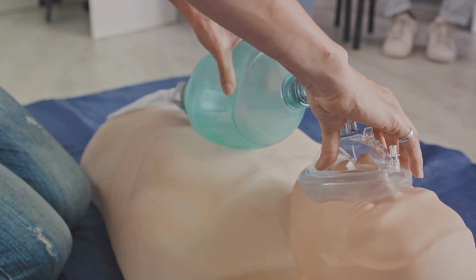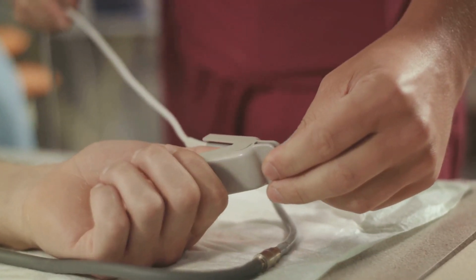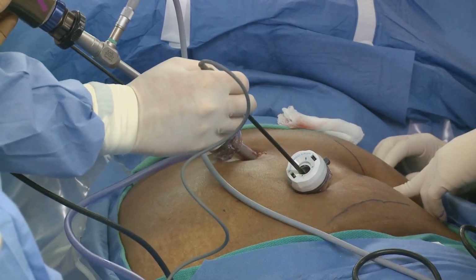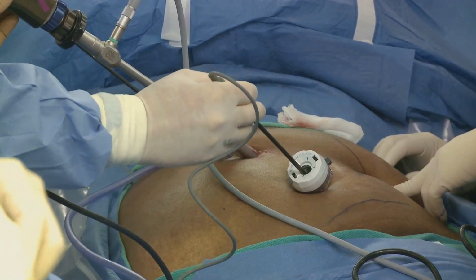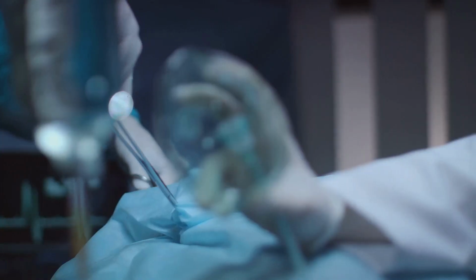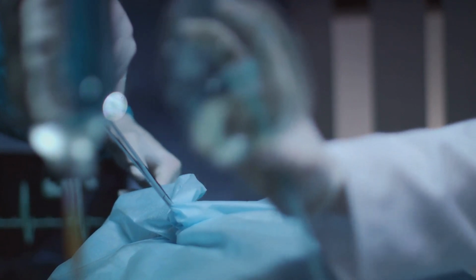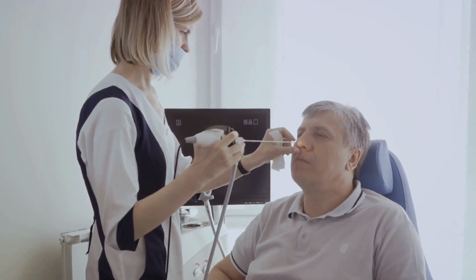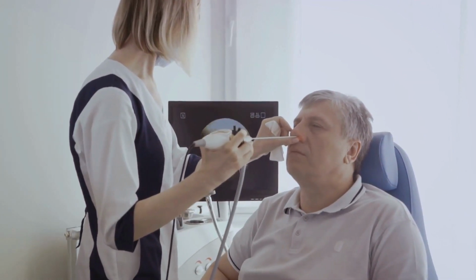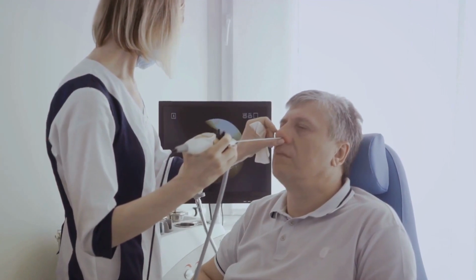In the direct laryngoscopy method, remember the importance of proper equipment preparation, patient positioning, and tube insertion. It is a method that relies on visual guidance and manual dexterity. On the other hand, nasal fiber optic intubation, often used when direct laryngoscopy is challenging, involves the use of a flexible fiber optic scope. This method requires a slightly different skill set, including proficient manipulation of the fiber optic scope and a keen understanding of the anatomical landmarks.